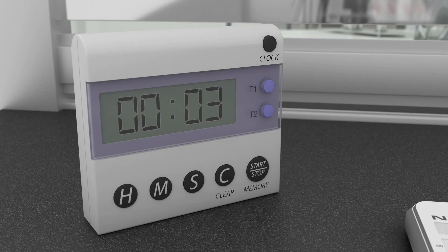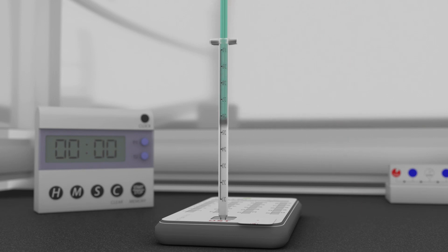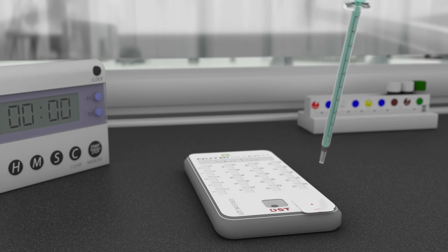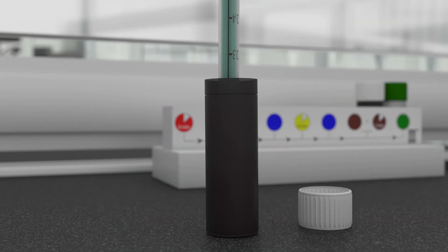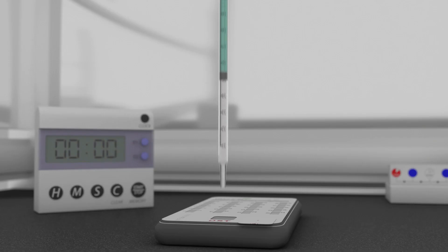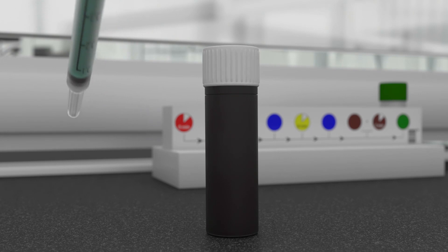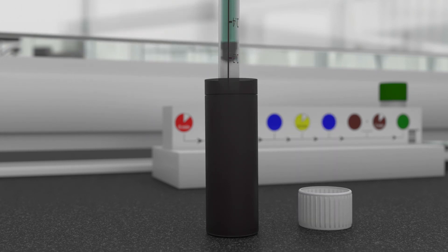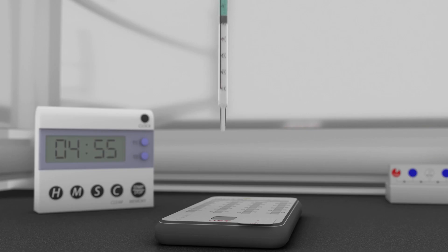Wait for the countdown timer to reach zero, then stop the timer. Inject the wash solution into the cassette. Remove the syringe. Remove the white cap from the brown bottle and pipette the entire volume of the first color reagent into the syringe. Make sure all the bubbles are removed and inject the first reagent into the cassette. Set the countdown timer to 5 minutes. Start the timer and immediately prepare the second color reagent. Remove the white cap from the second brown bottle and pipette the entire volume into the syringe. Make sure all the bubbles are removed and inject the second reagent into the cassette within 30 seconds of injecting the first color reagent.